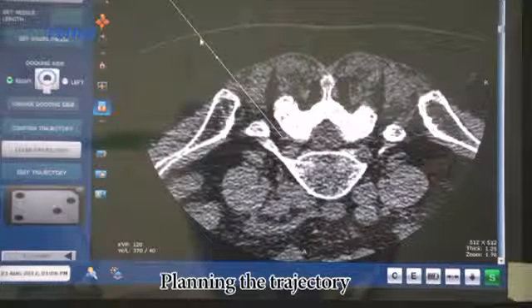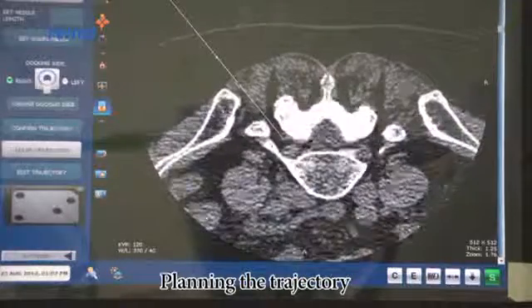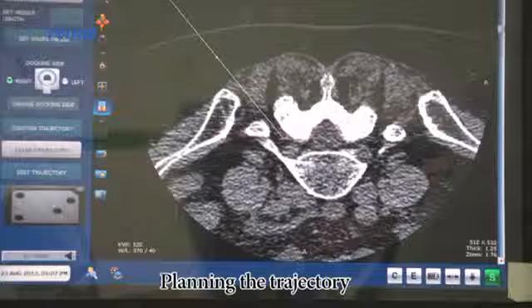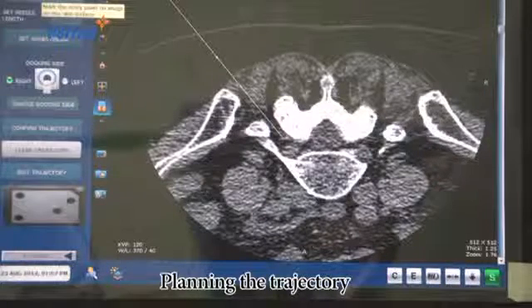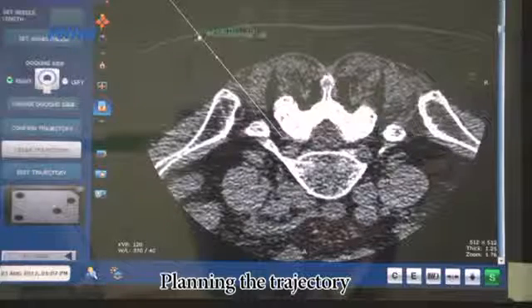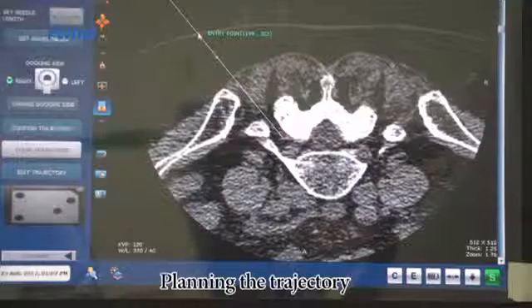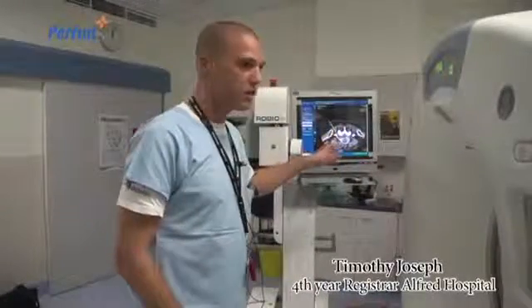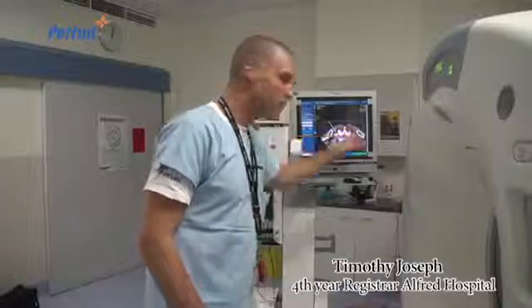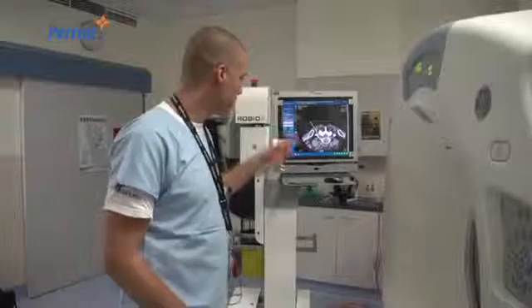The entry point at the skin is the next selection, and we could sort of head up and make an angled approach, but I think we'll stay on the same slice and set the entry point. And that's quite a nice direction right there. Essentially, this is I think a good case for the ROBIO, because you've got a very tight window, maybe 1 or 2 millimeters either side, where you've got some space.